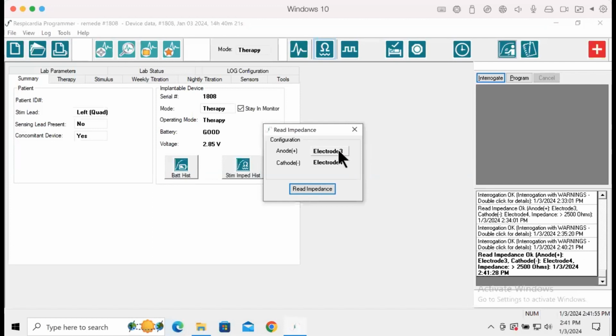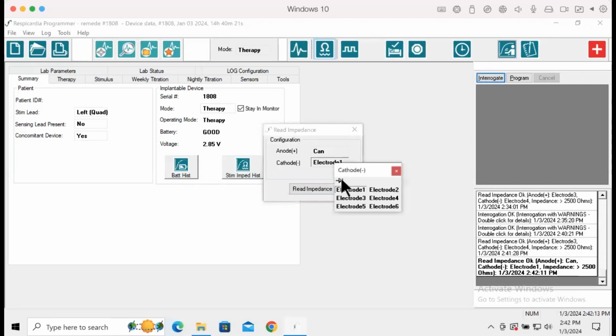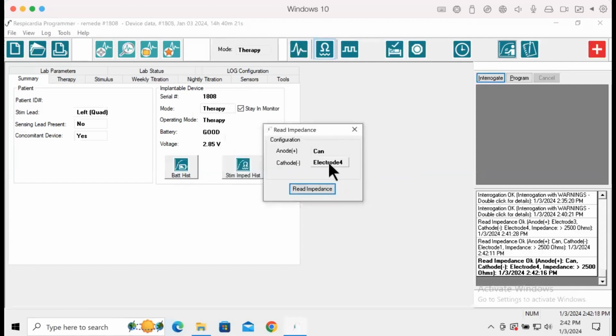To do this, change the anode to a can and the cathode to an electrode. In a left lead, you will have electrodes 1 through 4 and electrodes 1 through 6 for a right lead. Select Read Impedance and repeat this process for electrodes 1 through 4 for a left lead and 1 through 6 for a right lead by changing the cathode to another electrode while keeping the anode as a can.